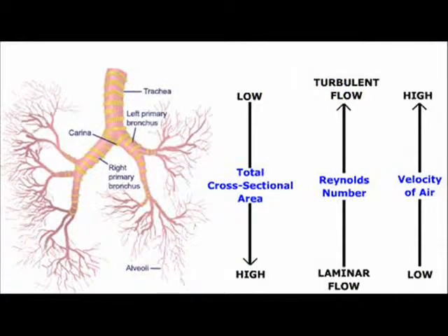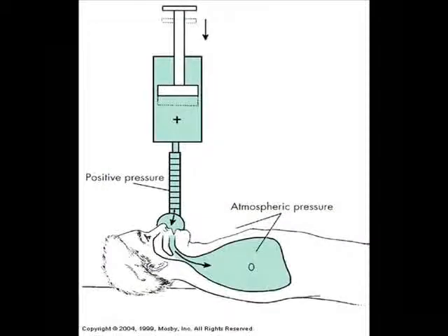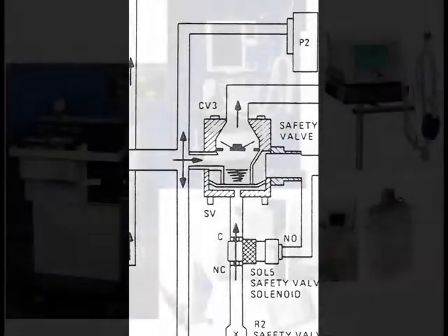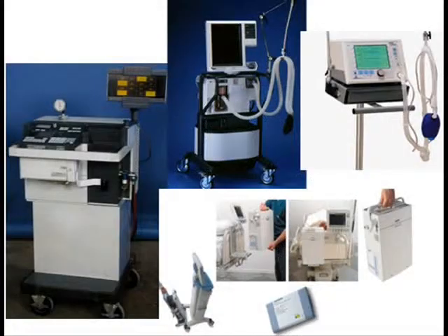Mechanical ventilation is part anatomy, part physiology, and part technology. By combining all of the aspects in this video, it is anticipated that the initiation of mechanical ventilation will be performed in a competent and safe manner.